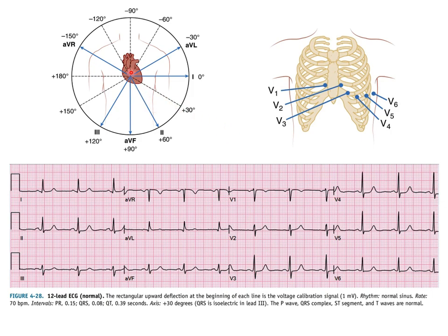So, here are the normal projections, the direction of the projections of those signals. You can imagine if you have a positive signal in, let's say this is V1 here. Let's look up here and say, well, where's 1? It's this one. So that means I have a positive voltage from here out to here. So there's a gradient across the chest this way that is positive, and it's a projection of the gradient that exists on the anterior wall of the heart.